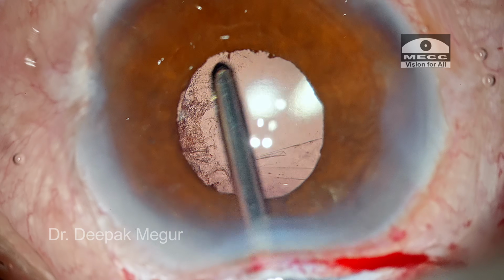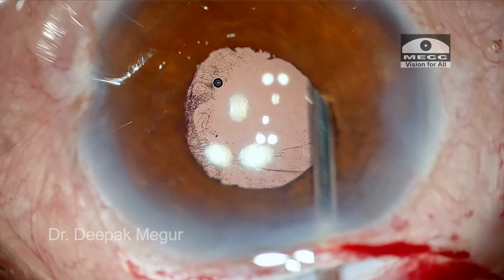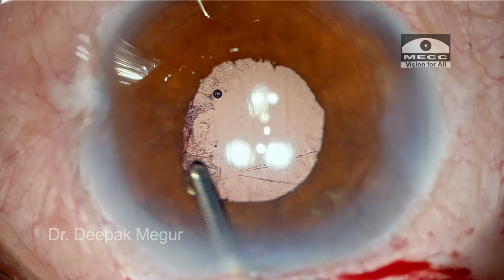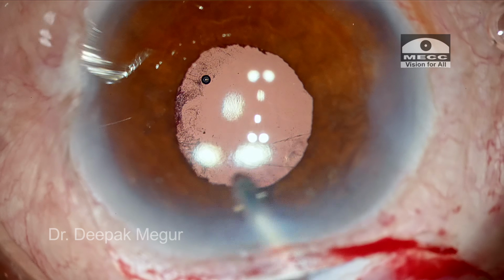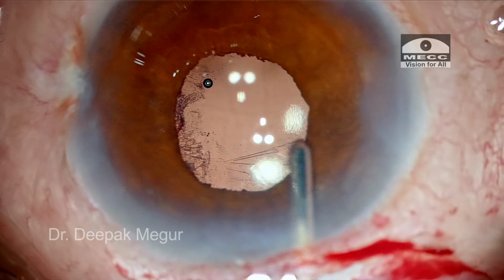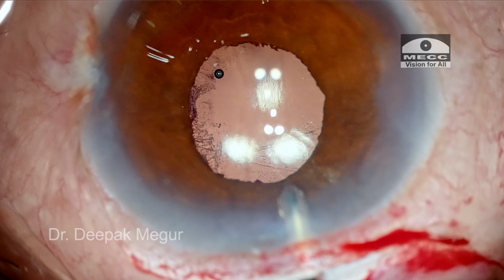Do I need to do an iridectomy in this case? Well, I'm not doing one in this case simply because I'm certain that there is no vitreous hovering around which can increase the risk of a pupillary block, and neither is there much lens matter inside. So if there is any risk factor of inflammation or pupillary block, the risk of a secondary glaucoma is a possibility. I don't see any of that. So I'm not doing any iridectomy.